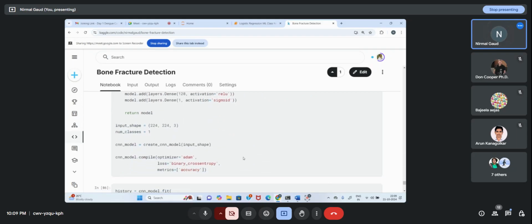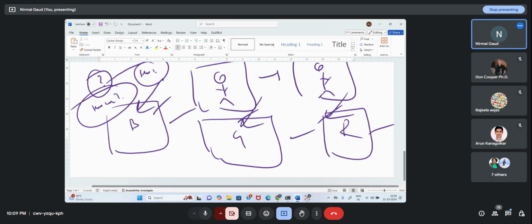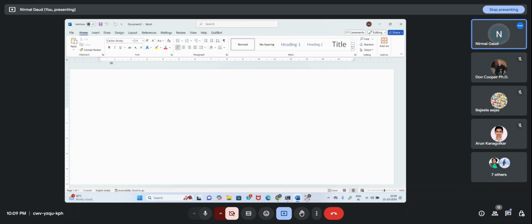No, sir. What do you think? What about others? Yes, yes. If you put some value here to the input data, obviously there is a change, sir. I can't say, neither you can say that there is no change.